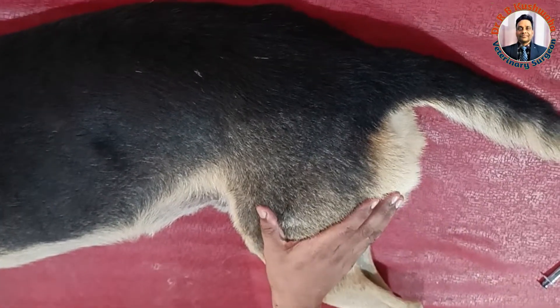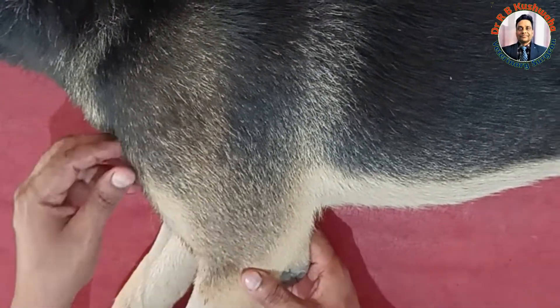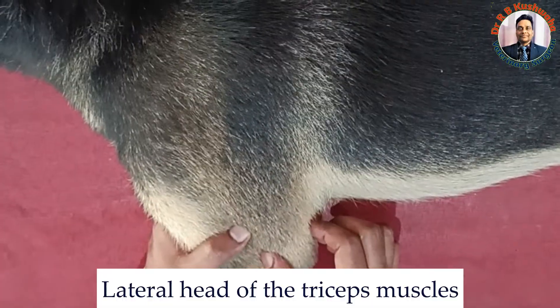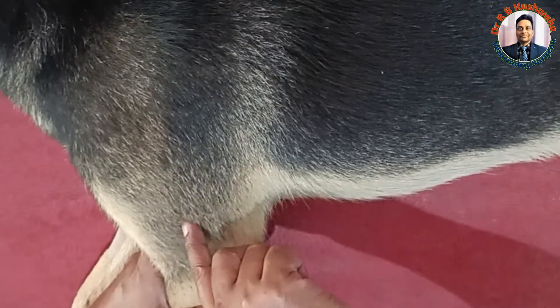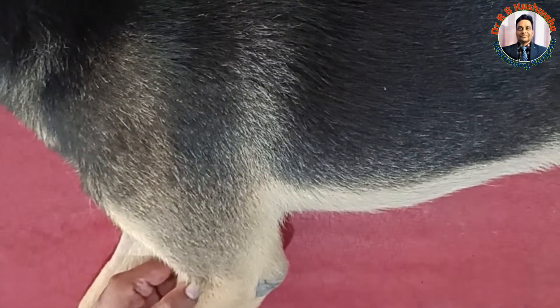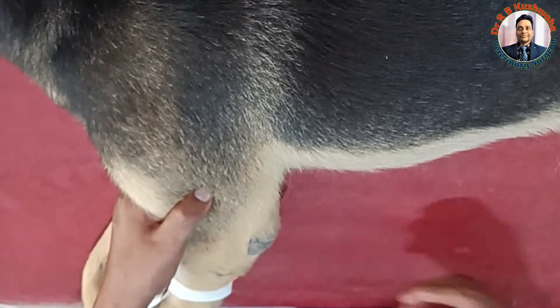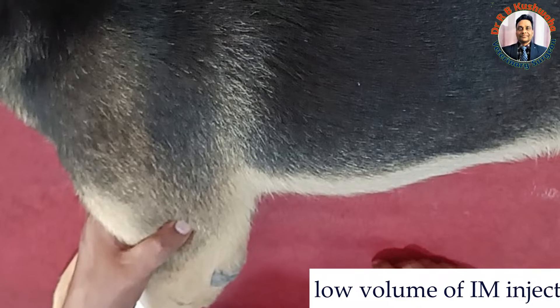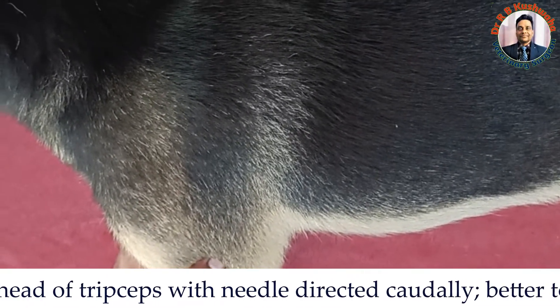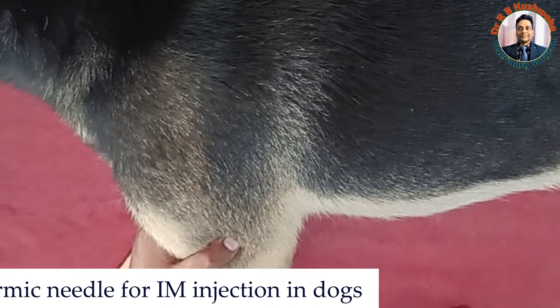Now coming to the forelimb. Here, the relevant anatomy includes the humerus bone, the greater tubercle, and the lateral head of the triceps. One important nerve runs through this area — the radial nerve — which crosses at the musculospiral groove laterally and supplies the extensor muscles of the radius. To avoid accidental injury to the radial nerve, keep the thumb of your left hand here. If the volume is less, pierce in the caudal direction in this area. This is the injection site in the forelimb, specifically in the lateral head of the triceps.